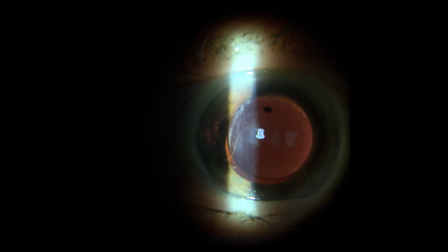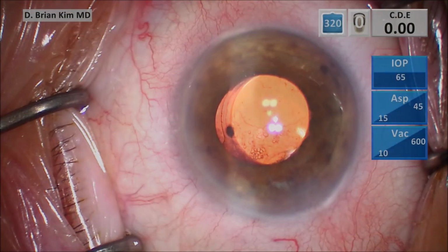Am I going to do a scleral fixated lens? Am I going to do a suture fixated lens? All of these decisions I have to think very quickly with this patient on the table. And I have a variety of options in front of me because I know how to do these techniques, so I can quickly pivot and make a decision based upon the situation in front of me. And that is really the point of this video, because unfortunately sometimes until you get in the eye you have no idea what you're dealing with, but once you get in the eye you can pause and then hopefully quickly pivot and make a decision which you feel is the best for the patient.